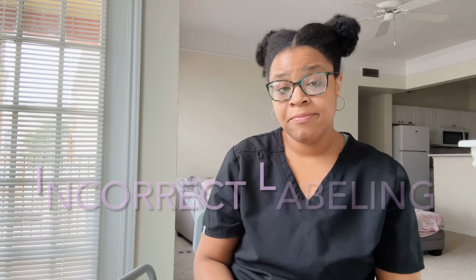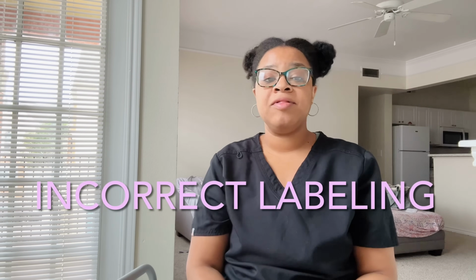Another common mistake is going to be incorrect labeling. Incorrect labeling is just that. If you draw a bunch of tubes, and the labels have the exact testing on there, like the serum may say serum, the EDTA may say EDTA, and you put the EDTA label on the serum one, this is where the incorrect labeling is going to be a problem, because it's not labeled correctly.